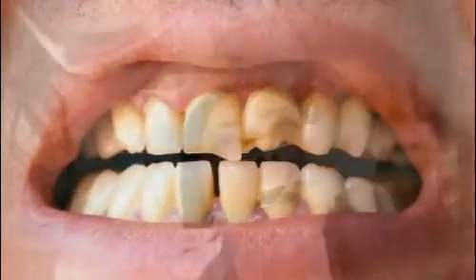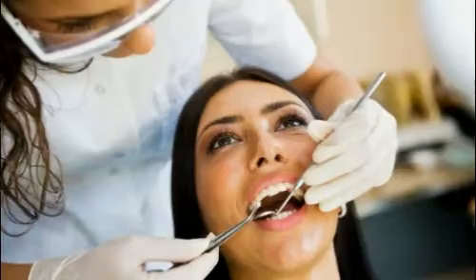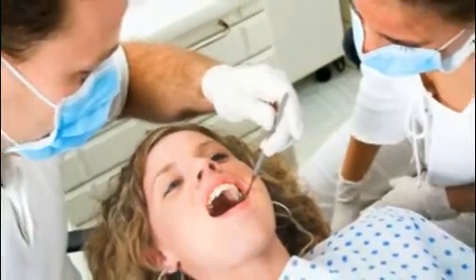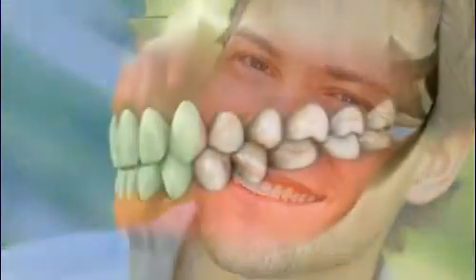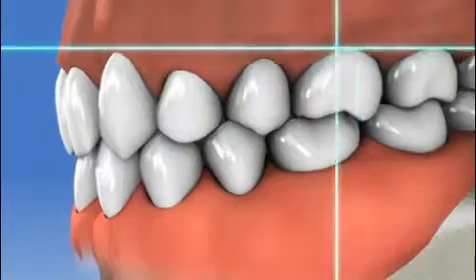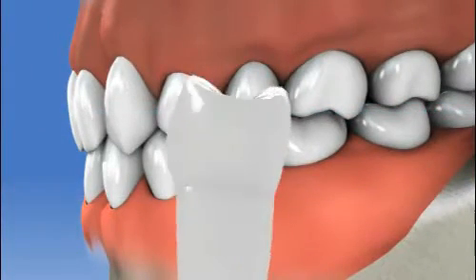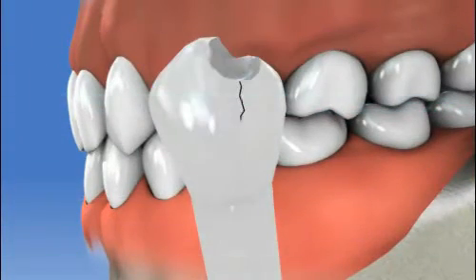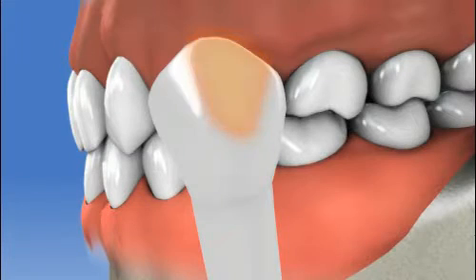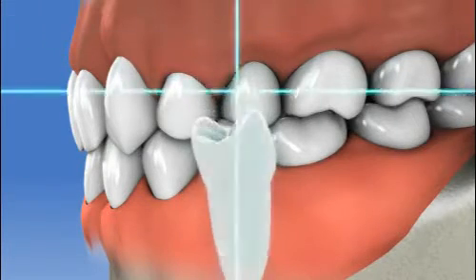One way that your dentist can help you regain a perfect smile is through bonding. Dental bonding is a technique where the dentist applies a liquid resin to repair damaged or discolored teeth and restores your smile. The dentist uses a special tooth-colored material called a composite, much as a sculptor uses clay. The material is shaped, molded, and bonded to the tooth. The result is a very strong natural restoration which can be very effective in most cases.